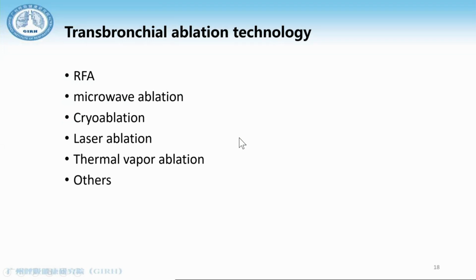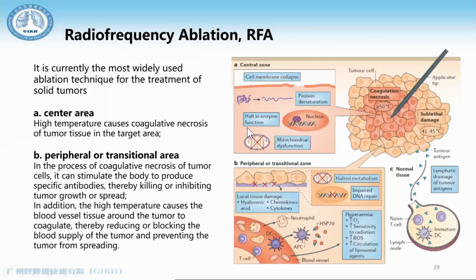For ablation technology, the options include radio frequency ablation, microwave ablation, cryoablation, laser, vapor, and others. Today I will focus on radio frequency. As we know, radio frequency is currently the most widely used ablation technique for the treatment of solid tumors.